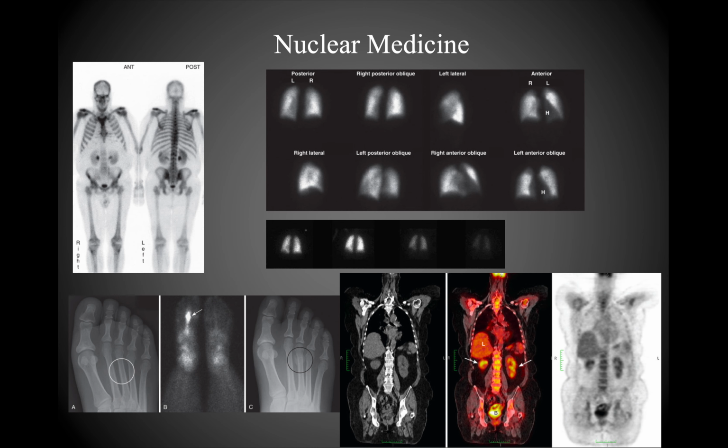So again, you can see that the liver is where this radionucleotide went for initial processing, and then it's excreted through the kidneys and ultimately down into the bladder. So really, from a nuclear medicine perspective, it's not so useful anatomically. It's really more useful from a physiological perspective. So it allows us to assess physiologic function.